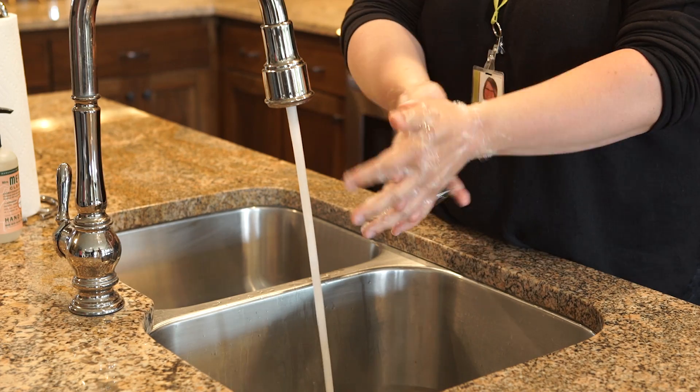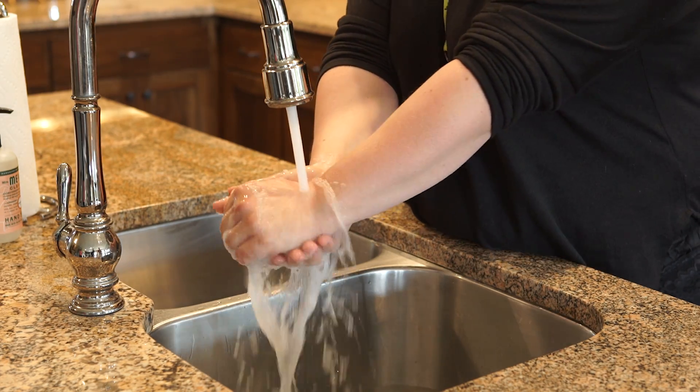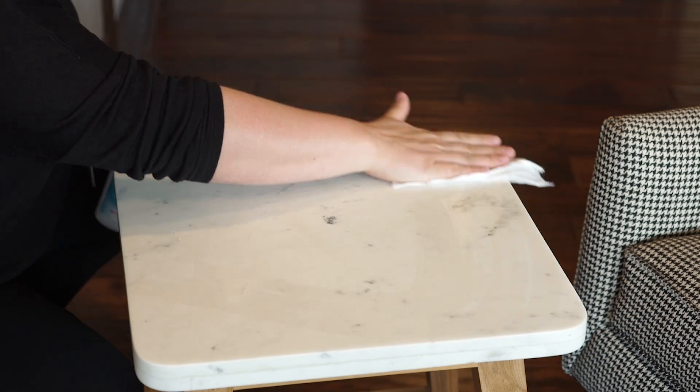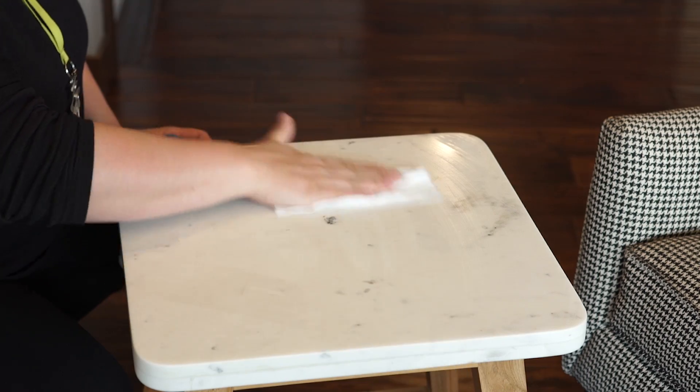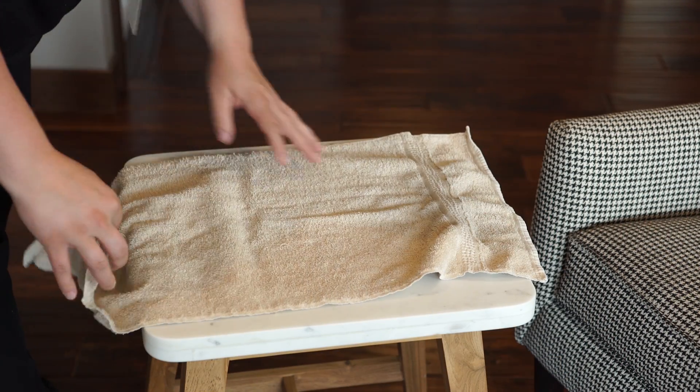Clean your hands with soap and water or alcohol-based hand gel. Clean your work surface with soap and water or a disinfecting wipe. Cover your work surface with a clean cloth or towel.